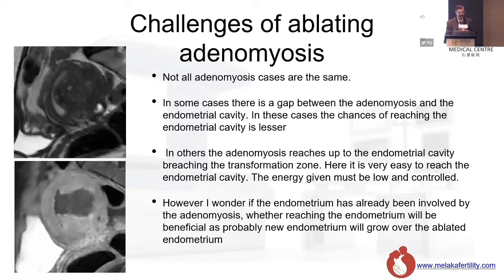Now here you can see an example. You can see this patient has got adenomyosis that has already penetrated into the endometrial cavity. When I ablate, I have reached it. Let's wait and see whether these patients can conceive.